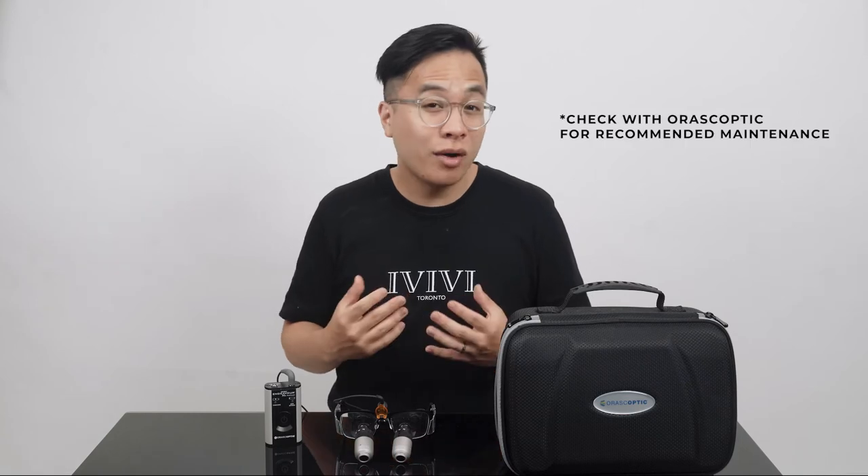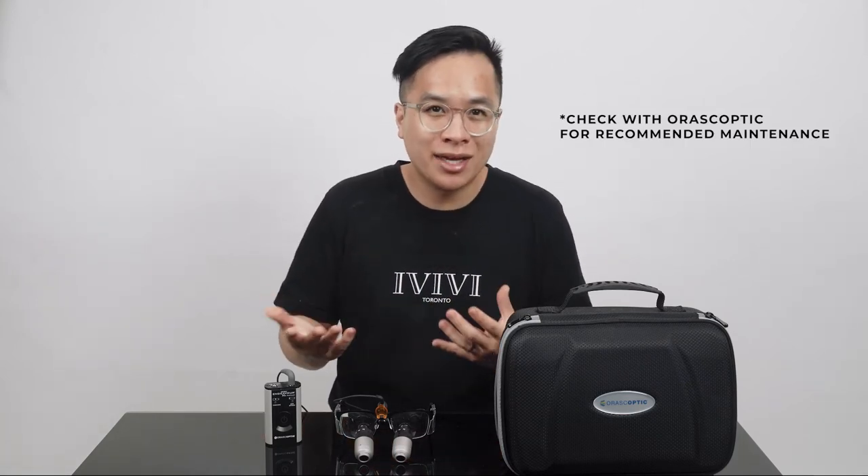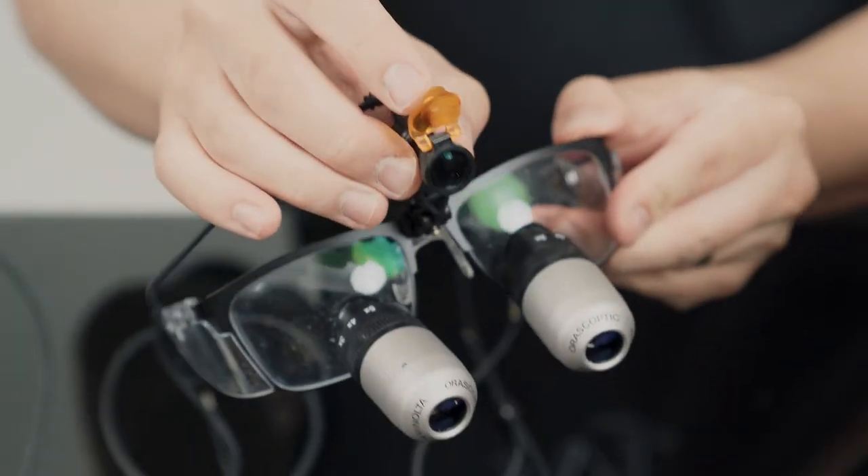Something you should know about the iZooms is that I was told you have to send them in for service once a year due to the moving parts. However, I do have colleagues who didn't even know about this and haven't sent them in, and they haven't had any problems so far.